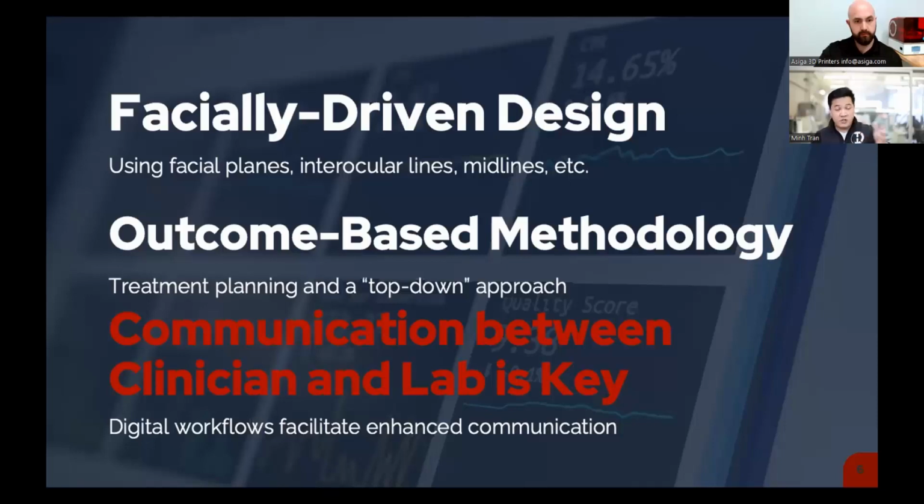And research has really found that nearly 65% of all humans are naturally visual learners, which means that they really need to see something in order to retain that kind of information, right? So using something as simple as a quick two-dimensional smile design as a visual aid to show the proposal to the patient and show them what the proposed outcome may be is an extremely powerful tool for increasing case acceptance rates significantly. So transferring these mock-ups from a smile design to a 3D printed model, using that as a template for an intraoral mock-up, we can further increase not only case acceptance, but also acceptance rates of a final delivered prosthesis or all these other products, due to the proposed aesthetics and changes that the patient has already approved beforehand.